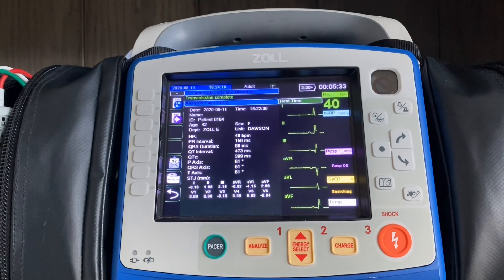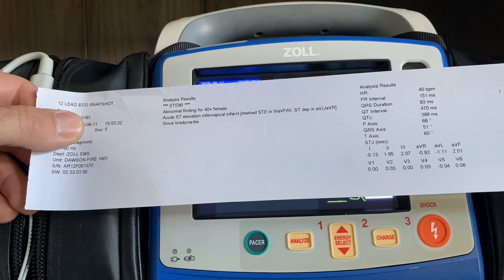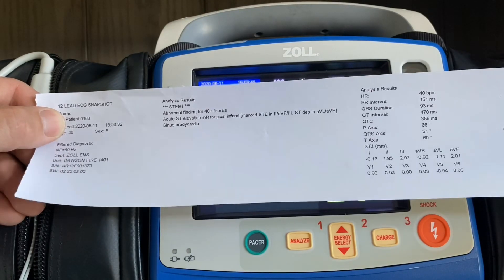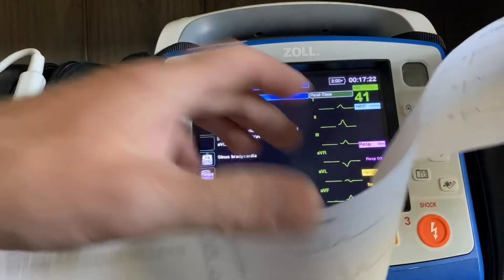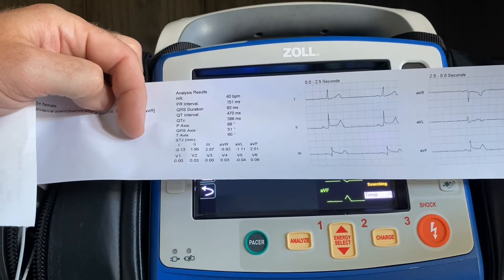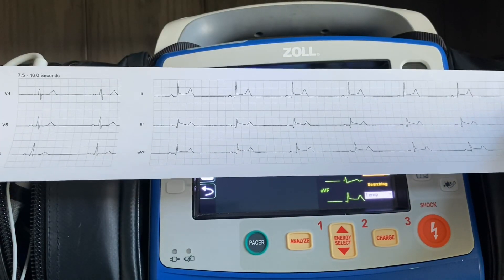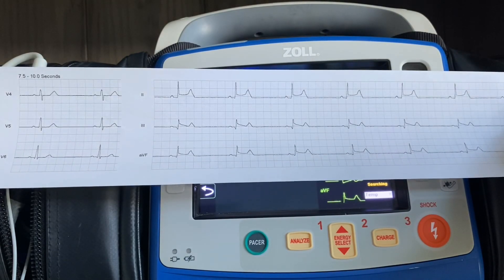Now let's take a look at the strip. The 12-lead itself will have three distinct sections. The first section is going to identify who acquired the 12-lead and what device it came from — which the hospital will also see — the interpretive statement, and your J-point measurements, showing the millimeters of elevation or depression off the baseline. The next section is the 12-lead itself. Then at the end of the strip, there'll be an additional 10 seconds of leads II, III, and AVF to help you determine whether or not you have inferior wall blockage on this particular chest pain patient.